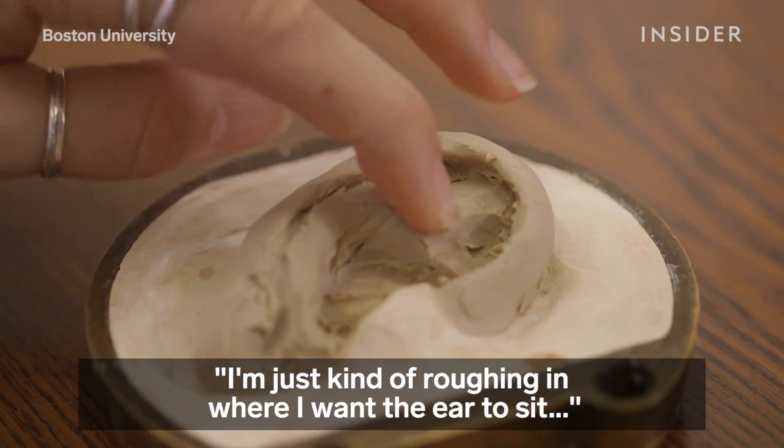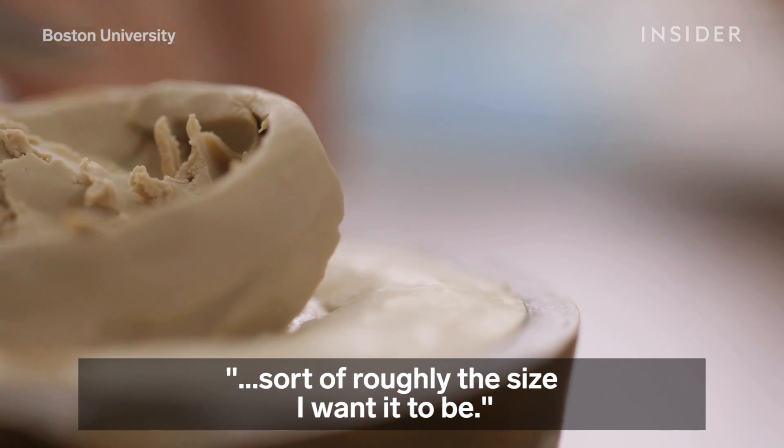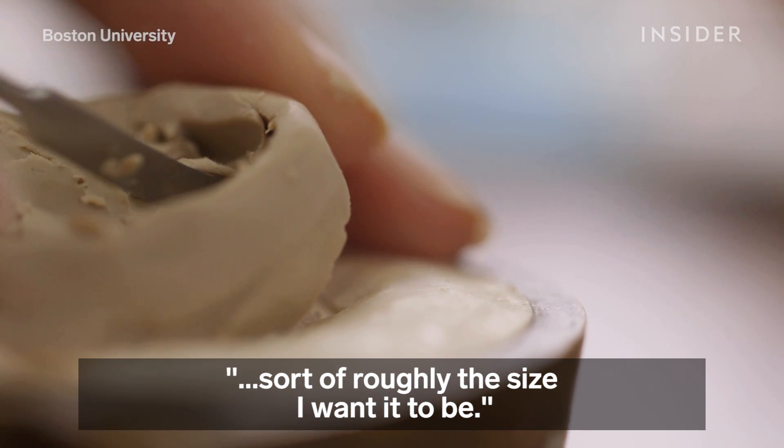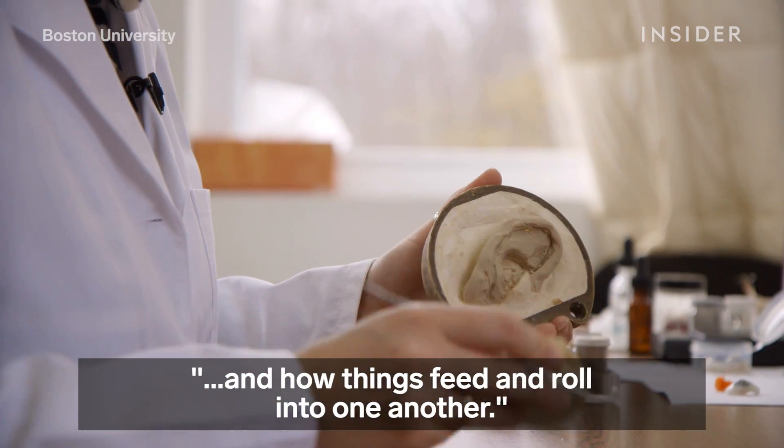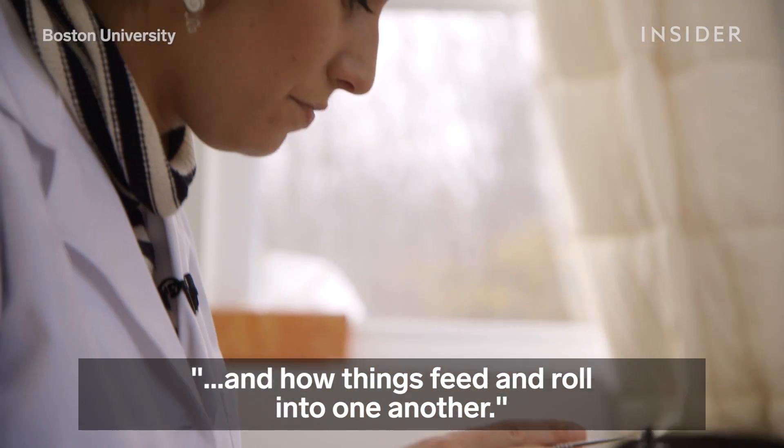I'm just kind of roughing in where I want the ear to sit, sort of roughly the size I want it to be, and then I'll start playing with more of the details of forms and how things feed and roll into one another.